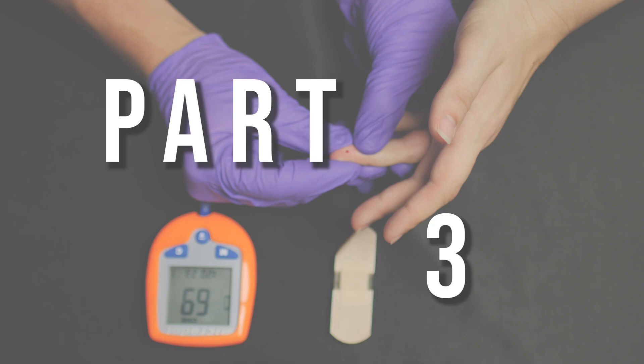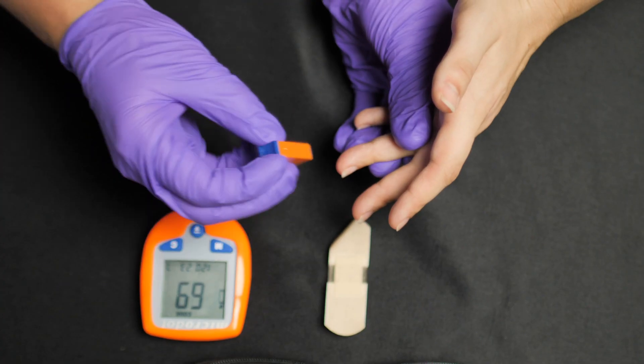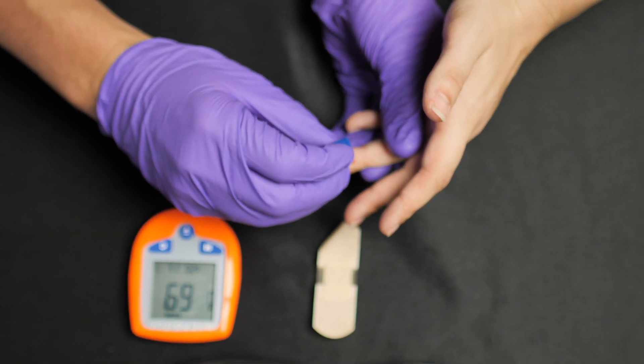This is part three of our vitals series. We're going to be talking about some diagnostic tools that are not necessarily vital signs, but still something we use in our assessments to try to figure out what's wrong with the patient and the extent of the injury they have. So let's dive in and take a look at blood glucose, pupil response, body temperature, and we'll even talk a little bit about some breath sounds.